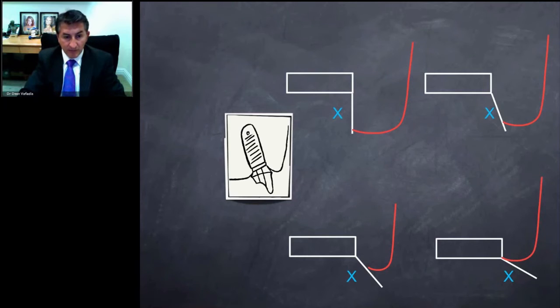We're looking at a model today where X is the depth of the tissue. When you remove the healing abutment, you can measure the depth of the tissue. And you can envision that as that emergence increases at each angle, that tissue will actually be moved down. So the angle, the tissue is directly related to how that angle gets displayed. Using this sort of mathematical model, we've created an algorithm that helps the technician and helps us out to figure out where the margin should be.